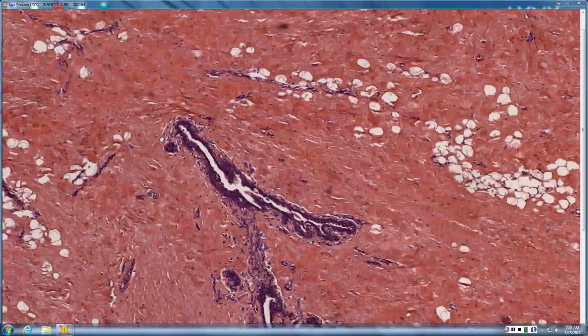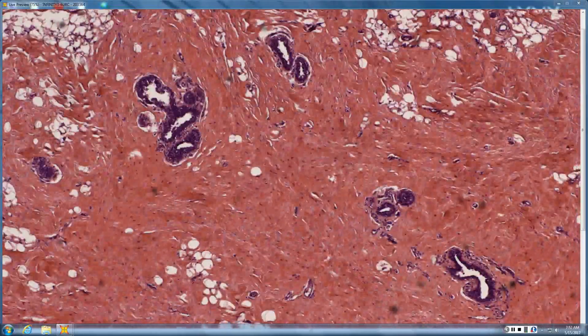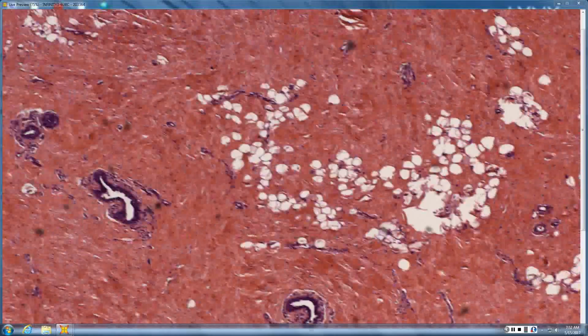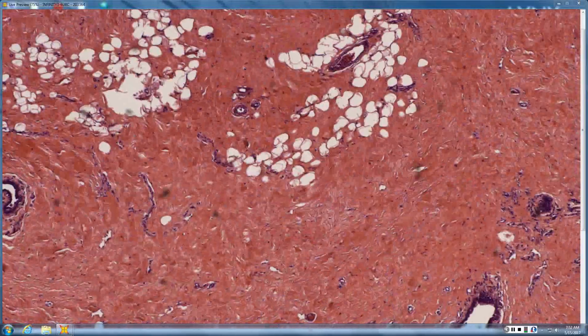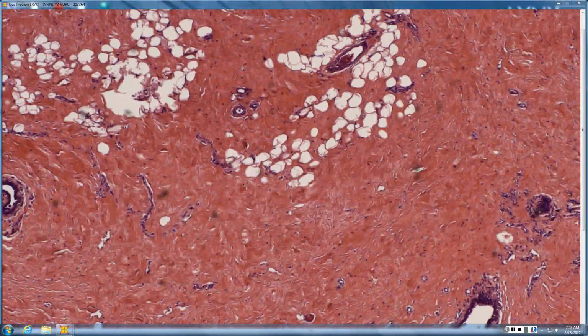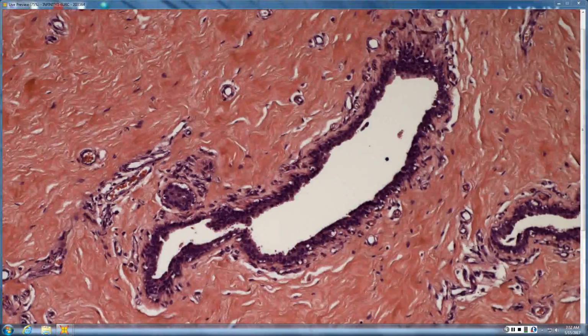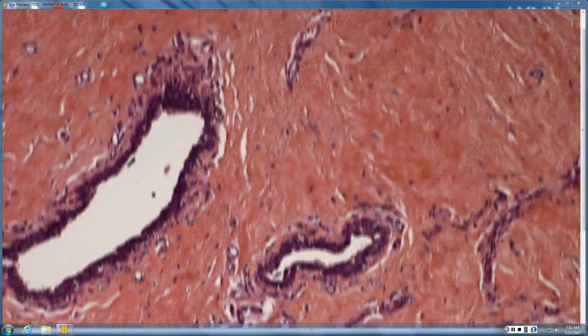Just a little papillary, and this is a teenage male with enlarging breast. So this is some ectopic breast tissue that was read just as benign gynecomastia. So, Nicole, you want to teach us about gynecomastia versus breast cancer?